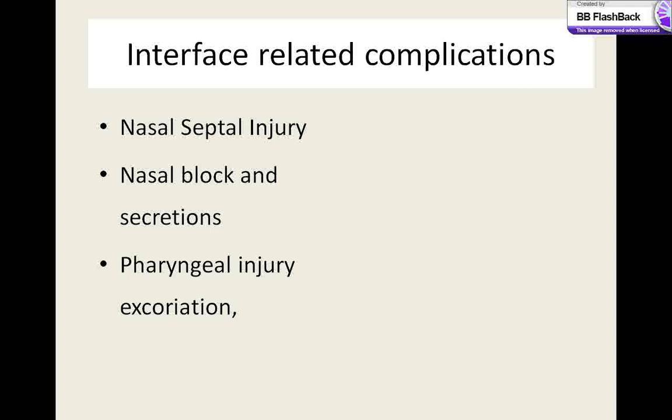Interface or inadequate humidification related septal injuries are the most common complications seen in babies while on CPAP. This itself can be responsible for failure of CPAP.